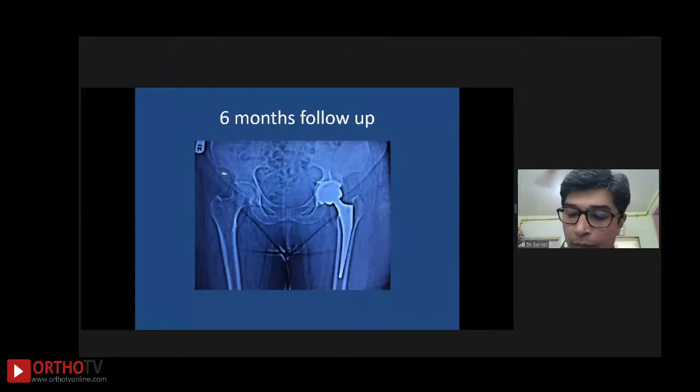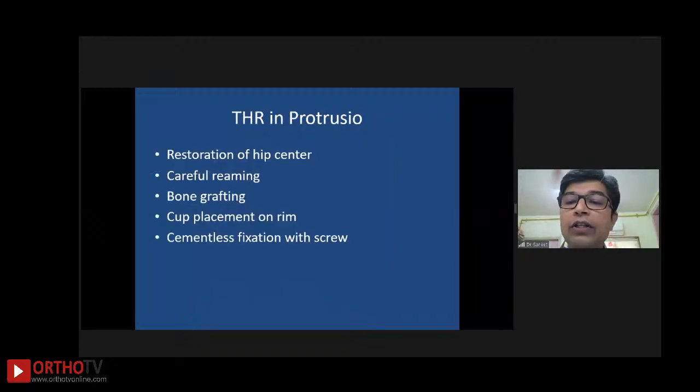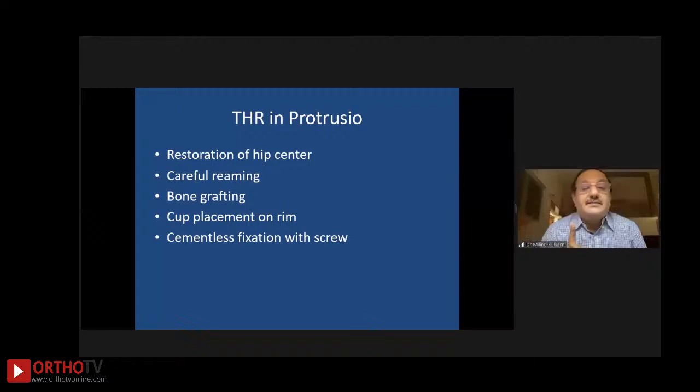So the point here is to restore the hip center, and I would suggest that preoperative templating is mandatory here. You should use the template and mark the hip center, and intraoperatively use the teardrop to locate your hip so that you don't medialize, but you should not lateralize the hip center too much also. Not too much, of course, yeah. Not too much, yes.